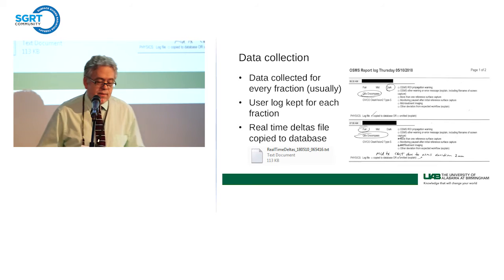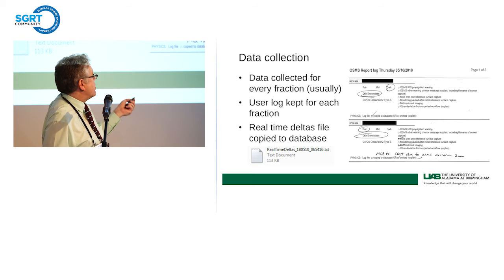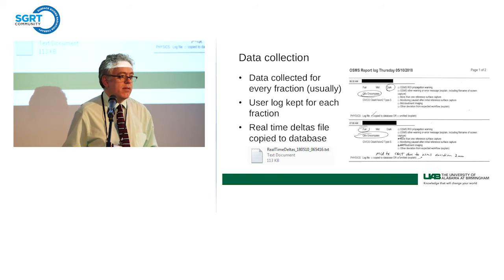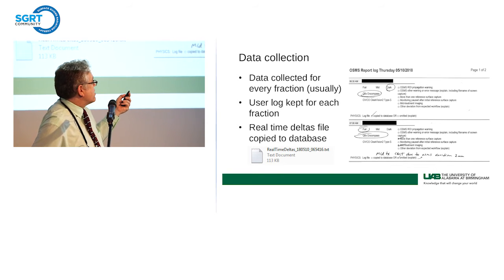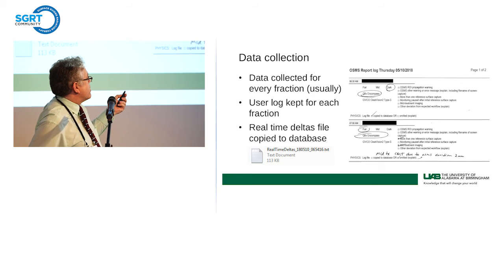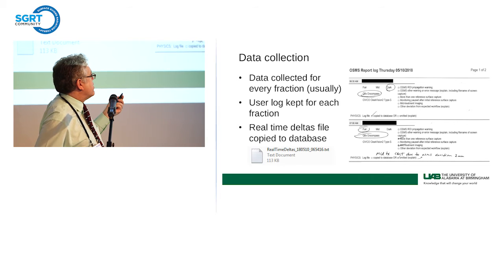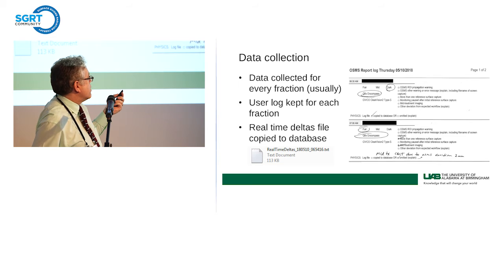And so we realized we really needed to log the data as it was captured. So we developed a log, and our therapists, every day, print this out. It's just an ARIA report that looks for the word OSMS or brain in the comments and puts it on this worksheet. These are two examples. So this is a patient. They note what the skin tone setting was, what device we used to immobilize the patient. This is the same every day now. I mean, we switched to this device permanently last fall.